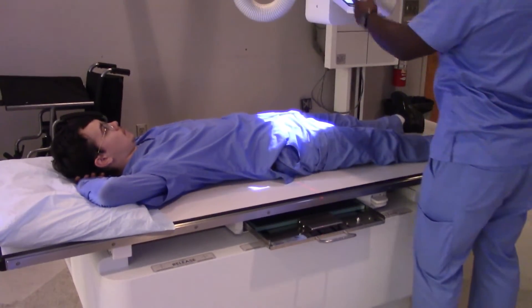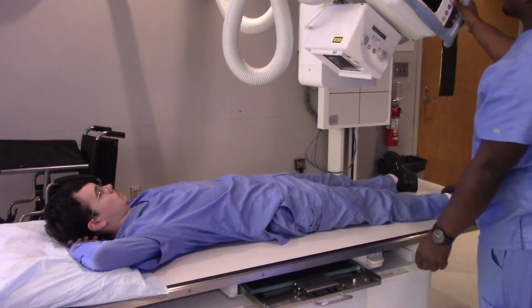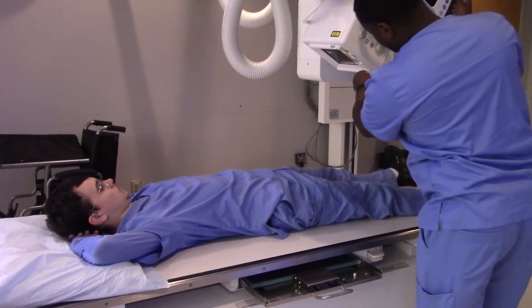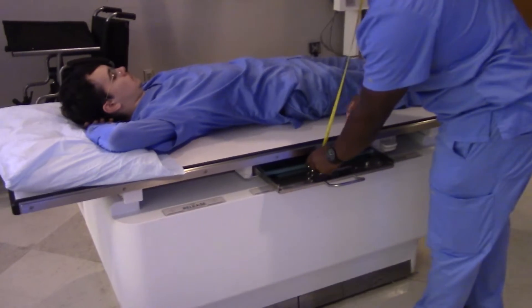When we say 40 inch SID, what we mean is 40 inches to the image receptor, as opposed to the tabletop. Just being nitpicky. That's about one meter SID.